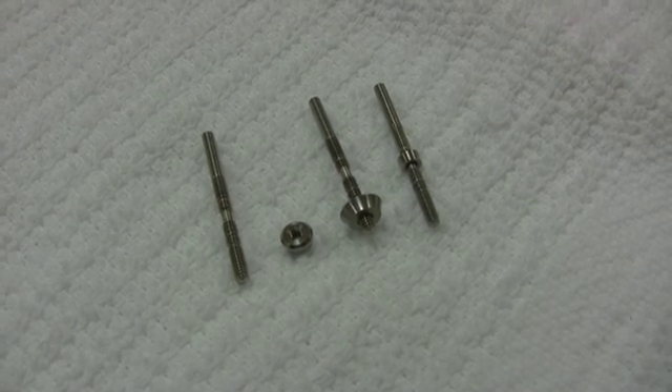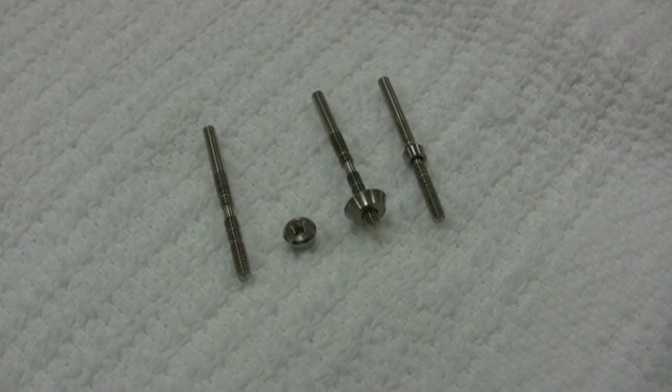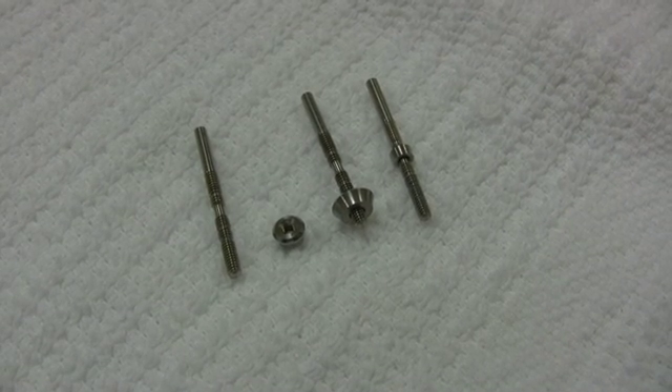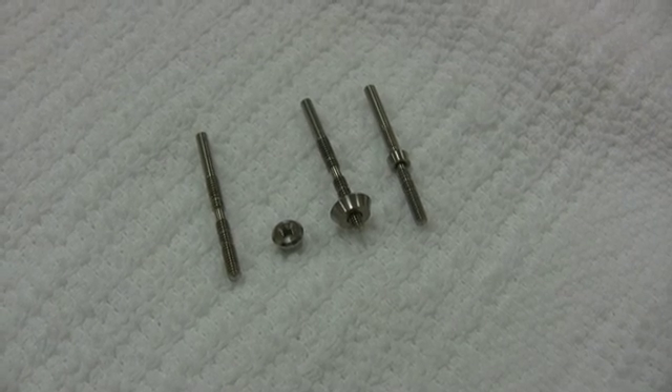Hello, my name is Dr. Emil Verbin, developer of the Verbin Depth Gauge. I've been placing dental implants for 20 years and invented this gauge to aid in the placement of implants with a 1.8mm polished collar.